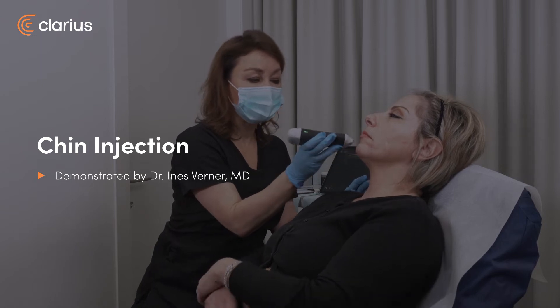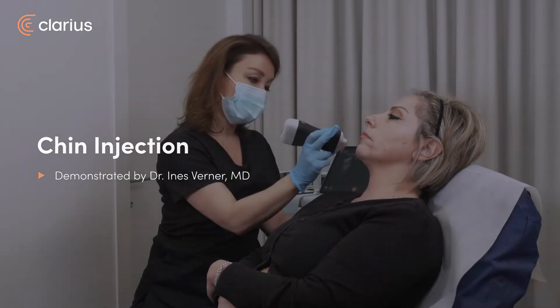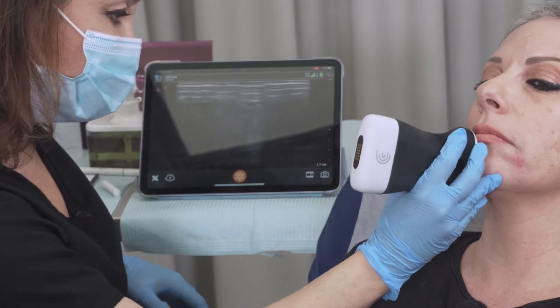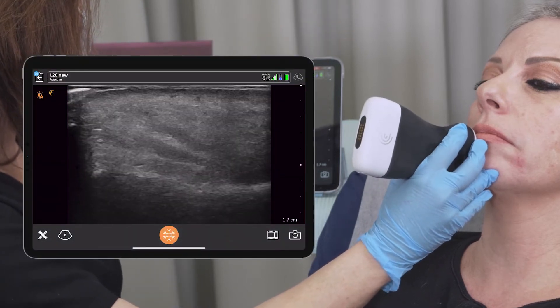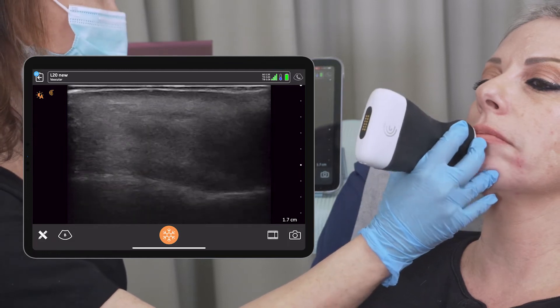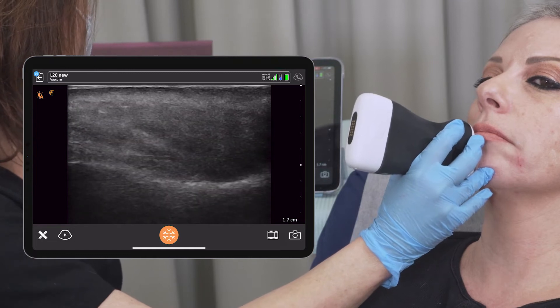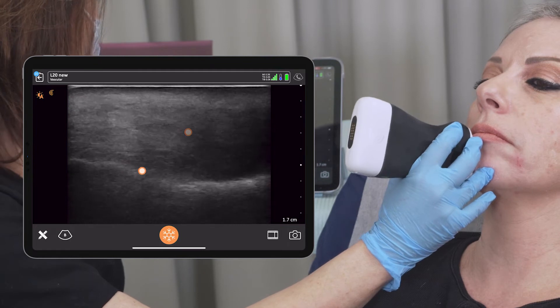In the chin, the main muscle is the mentalis muscle, and we're going to check that. Here you can see the muscle, because most of the chin is actually the mentalis muscle, and the white line is the bone.